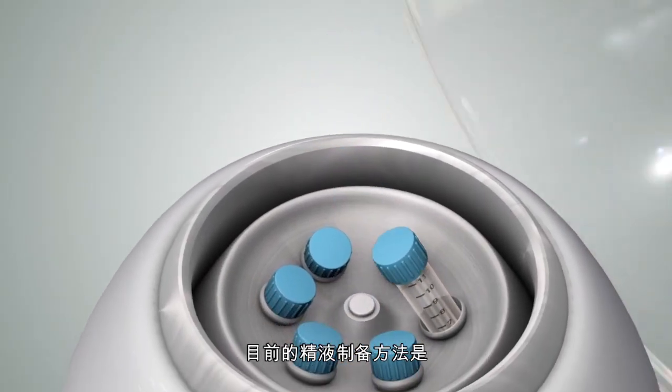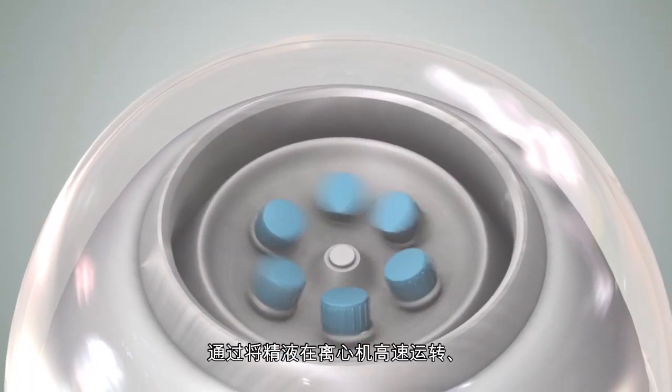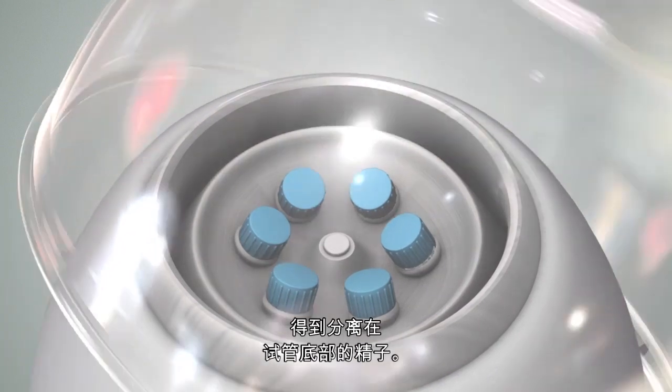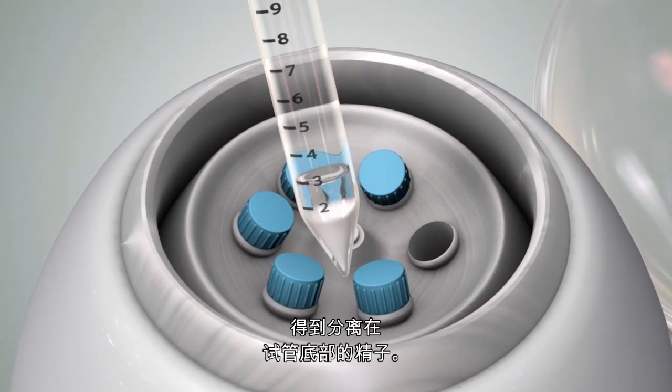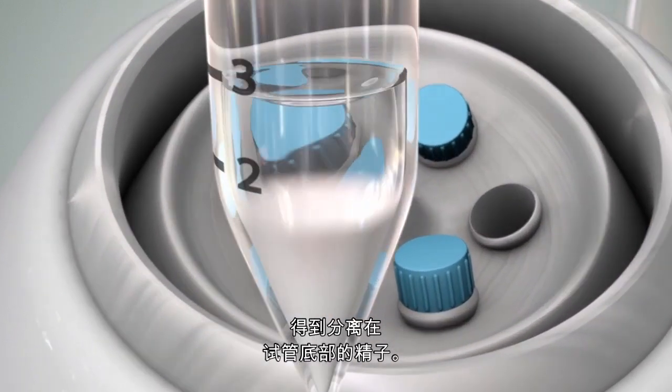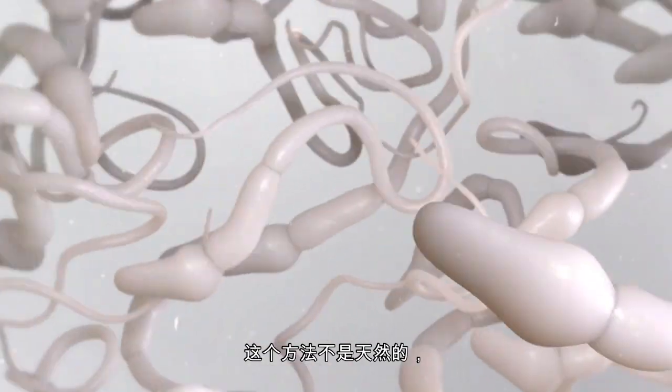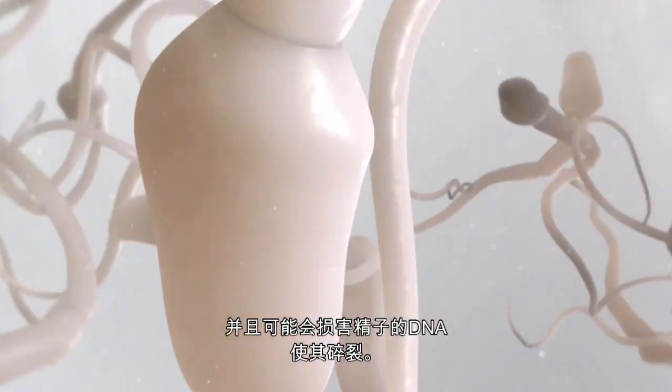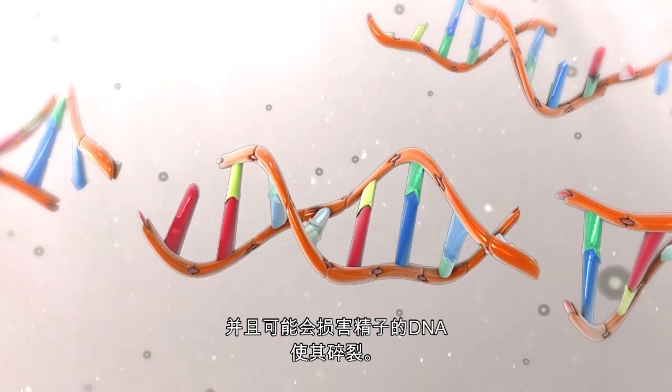Current methods of semen preparation involve high-speed centrifugation of semen in order to isolate a pellet of sperm at the bottom of a test tube. This method is not only unnatural, but may cause the delicate DNA strands to break into pieces.